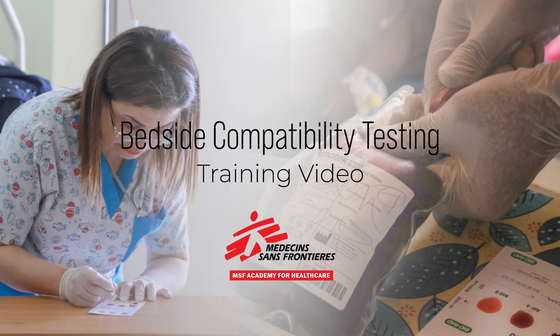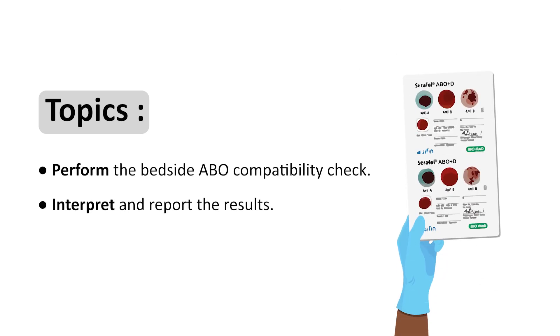Hello and welcome to this educational video. Today we will demonstrate how to perform the bedside ABO compatibility check and how to interpret and report the results.